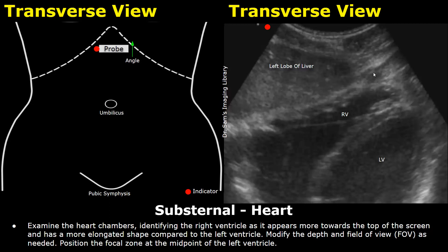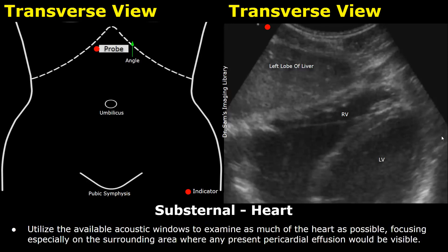Modify the depth and field of view as needed, and position the focal zone at the midpoint of the left ventricle. The region around the heart is the area of interest during a FAST scan. We need to look for anechoic fluid within the pericardial space. The pericardium is visible here, and fluid will accumulate within the pericardial space in case of pericardial effusion.